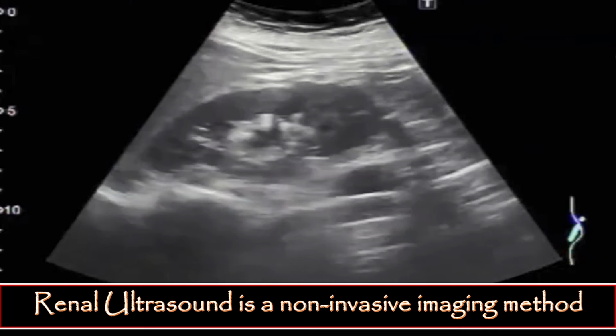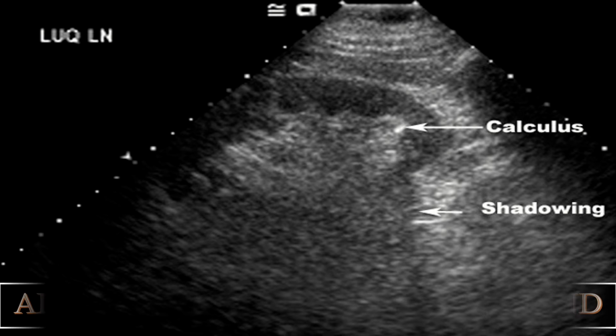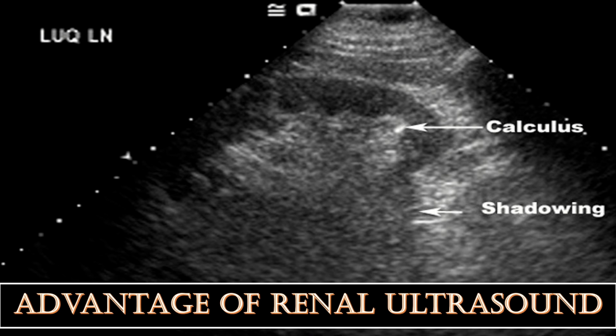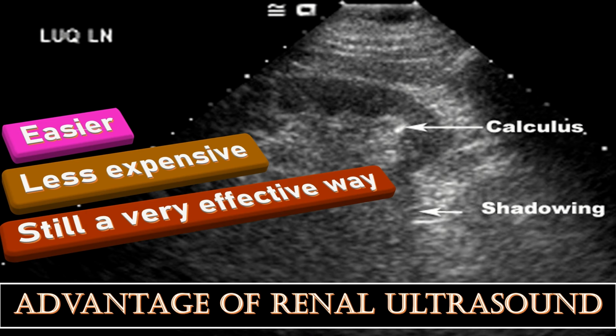While CT scan may show a little more detail, a renal ultrasound is also commonly used and preferred. The main advantage of renal ultrasound is that it is easier to schedule, less expensive for the patient, and still a very effective way to diagnose kidney stones.